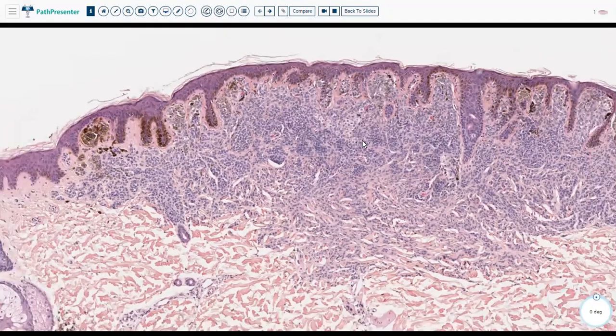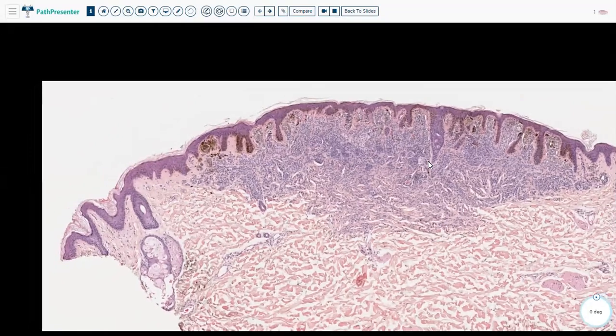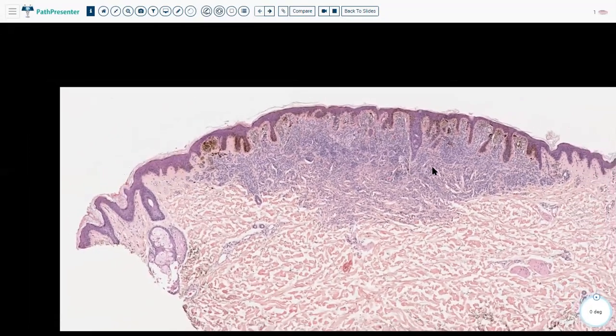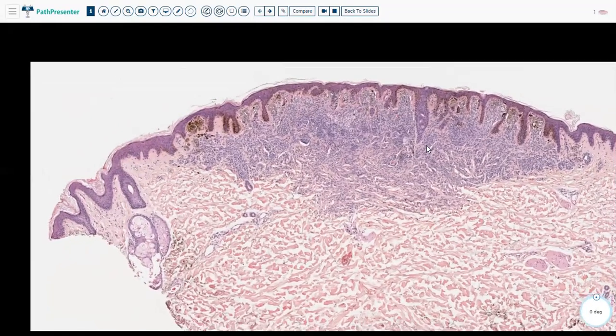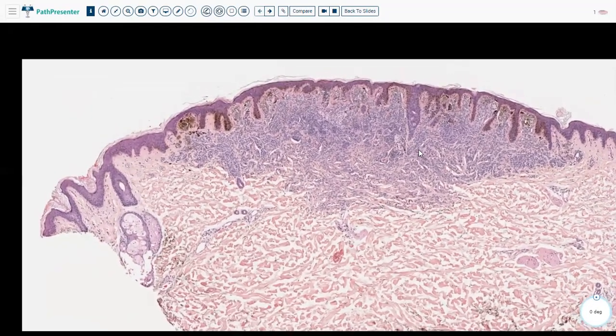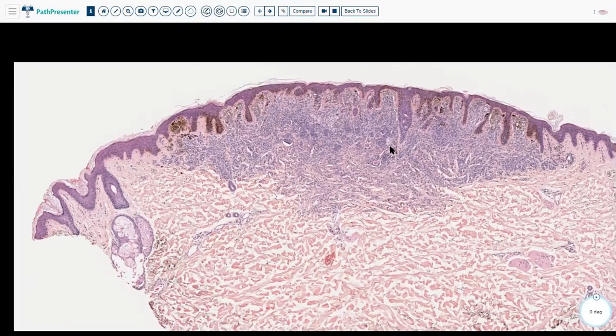So what are the features of a normal nevus, whether junctional, compound, or intradermal? The most important thing when you see these lesions is to know that this is a nevus rather than a melanoma. In this example, there are a lot of features that hint towards a benign nature. You can freely type any features that you see here, and I will confirm if it's right or wrong. Feel free to give examples while I'm explaining.